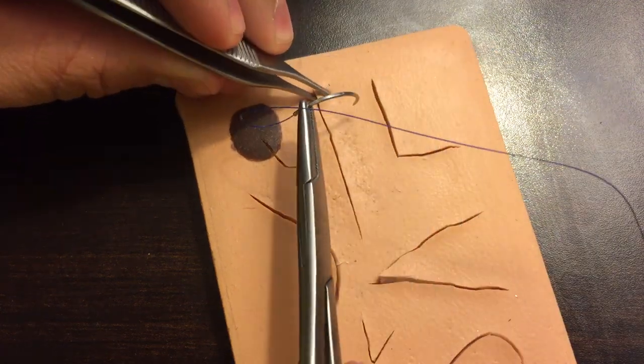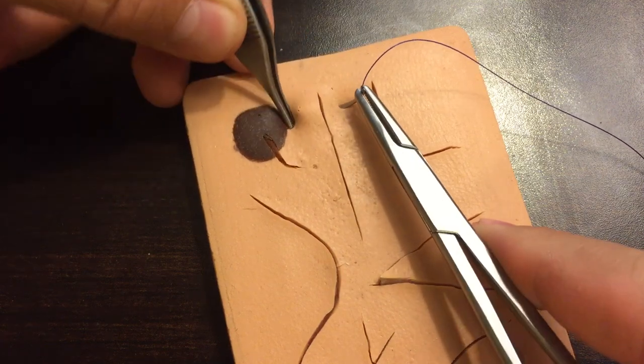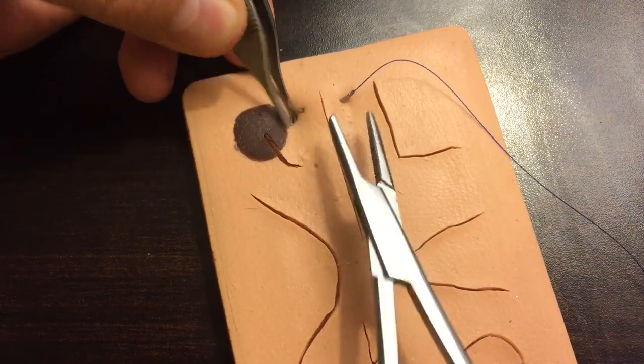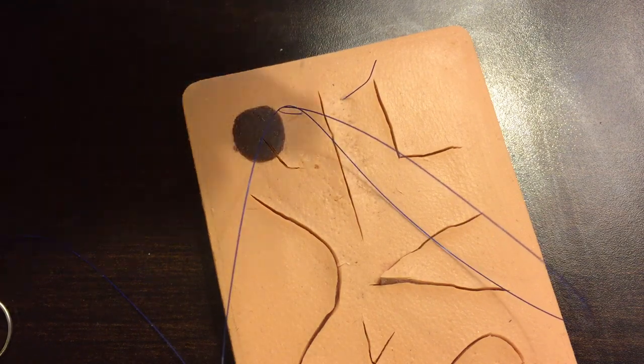So first of all, it actually starts with a simple interrupted suture. So let me place that quickly. If you would like some explanation or instruction on how to perform a simple interrupted suture, please check out my video on simple interrupted suturing.